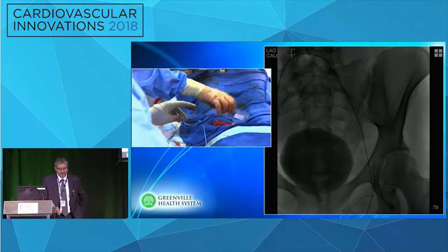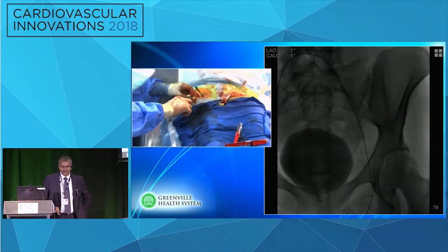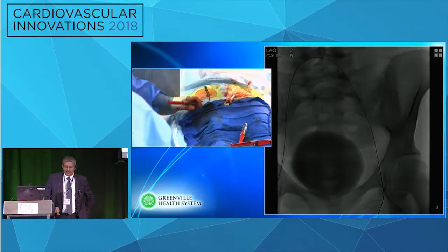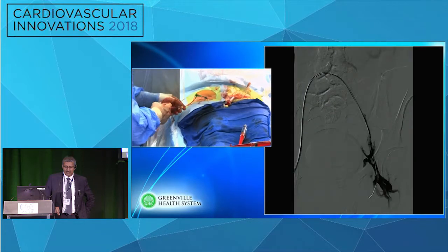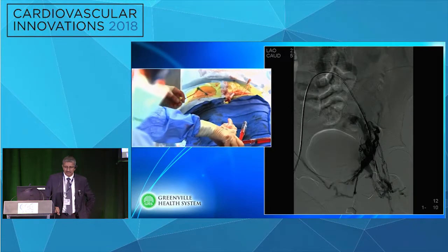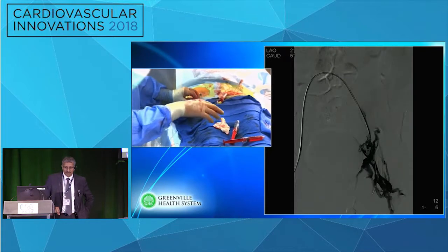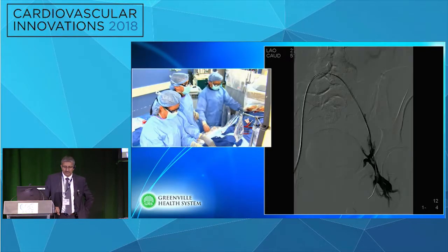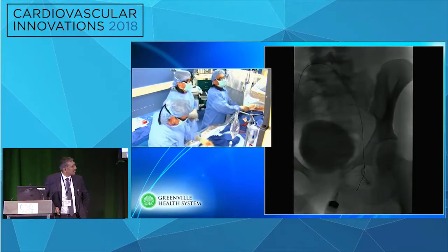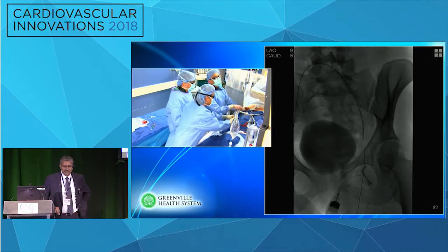So, I also like what that common femoral vein looked like there. It looked okay. It looks like we're not going to have to go down really low. I'll give you a little run right here. Actually, all right. I'm not sure this is normal, the common femoral. I'm not sure this is the main common femoral channel, honestly. The collateral network seems to be just a shade higher. Okay, go ahead. Flip back there and come on back.